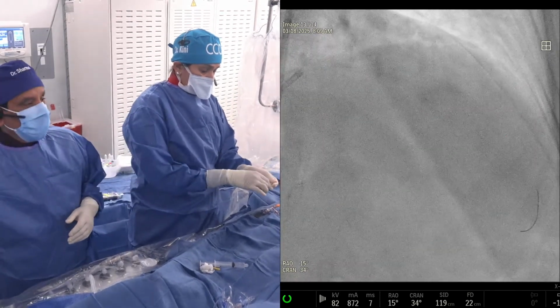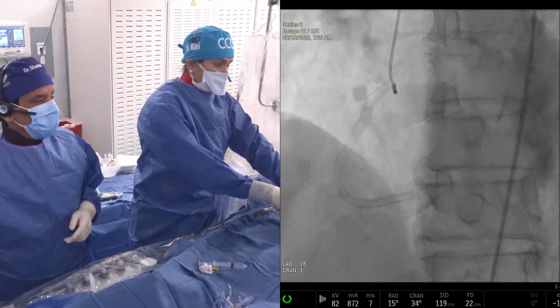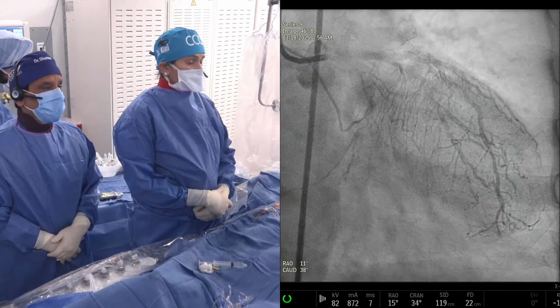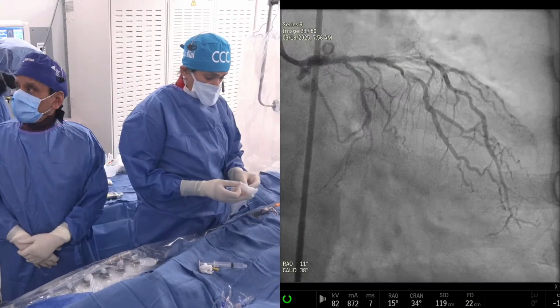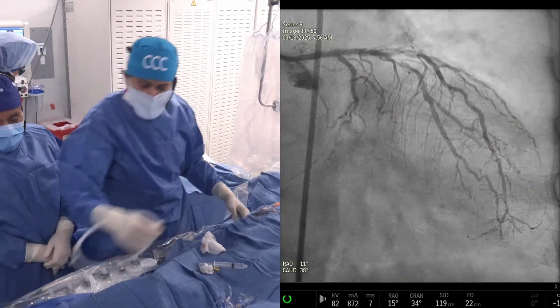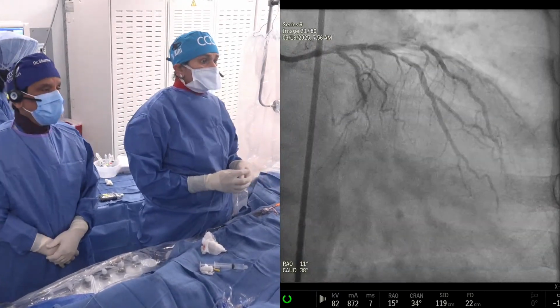We took a picture of the right coronary, and you see the LV is good. This is the right coronary, still looks fantastic. And now to where the money is. Look at the calcium, severe. The real question here is whether the left main is critical. The left main actually looks worse now than before. It looked like 30% before, now it's more. RCA is good, and now the left main.